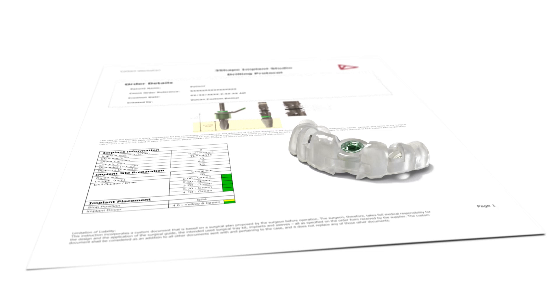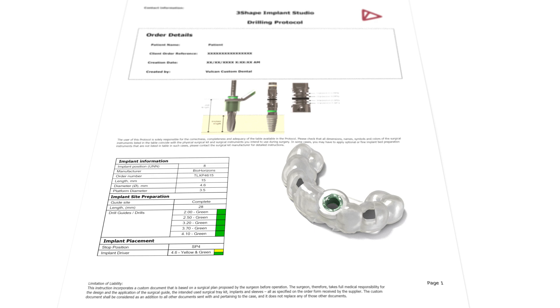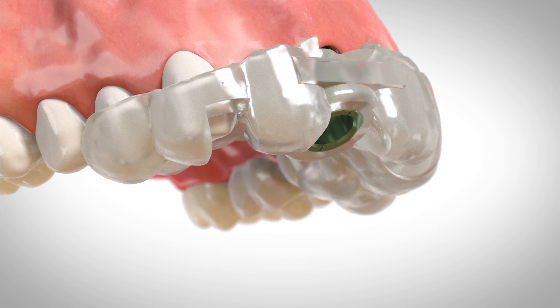The guide manufacturer will provide the surgical guide along with the surgical protocol, detailing the instruments to be used for the case. Once the surgical guide is seated, begin the surgery using the instruments specified in the surgical protocol.